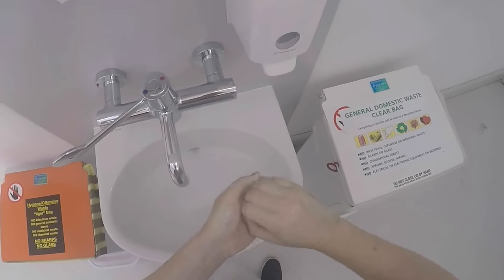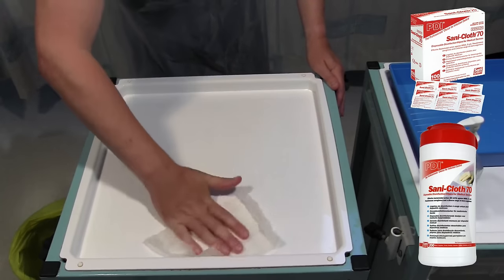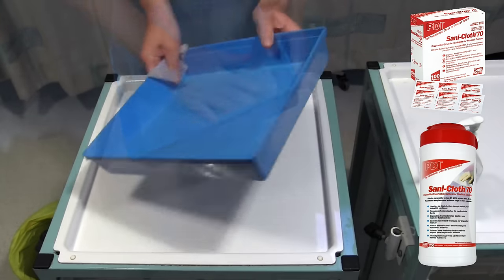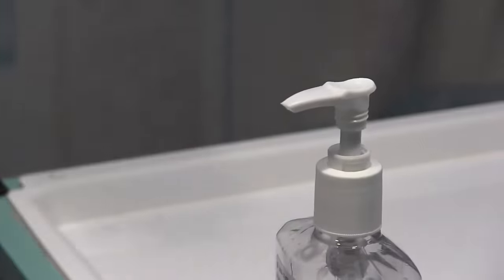Wash your hands with soap and water using the 7 step process and then put on an apron. Clean both your trolley and the tray thoroughly with an appropriate wipe or if they are visibly dirty use detergent and water first. As you have been cleaning, wash your hands.